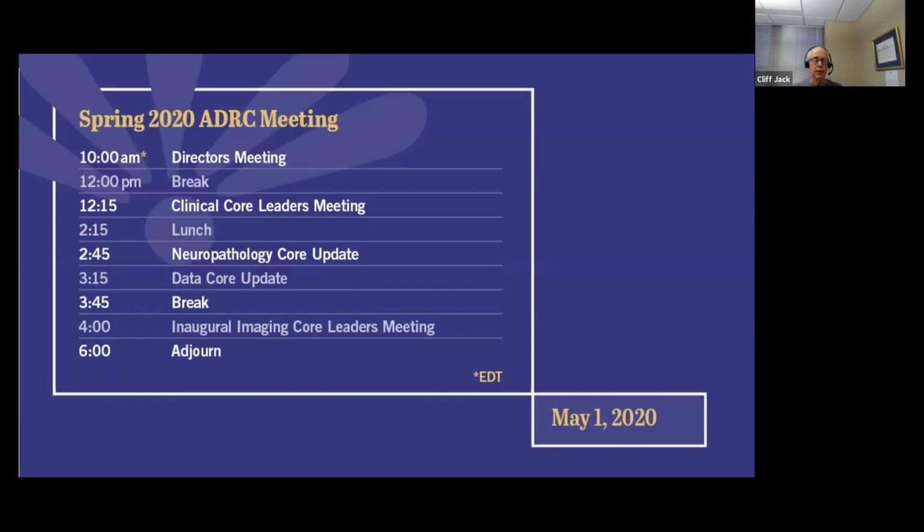And we think that by only requiring two sequences in order to, quote unquote, qualify for ADC compliance, that leaves plenty of time in a typical exam to do other things that you want to do. In this case, what you're saying is do a 0.8 millimeter cubed T1.